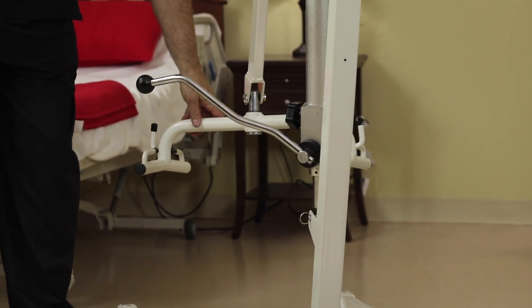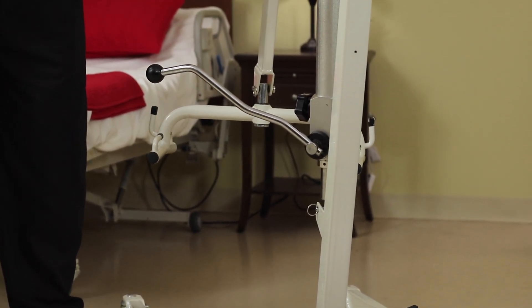It incorporates a six-point spreader bar, which is a more advanced spreader bar than a lot of the lower-end hydraulic lifts on the market. This spreader bar can be used with multiple styles of slings — all of the slings in our product range, as well as many slings from our competitors.